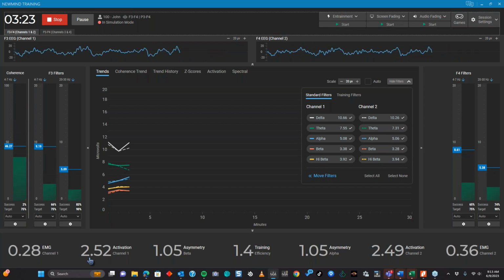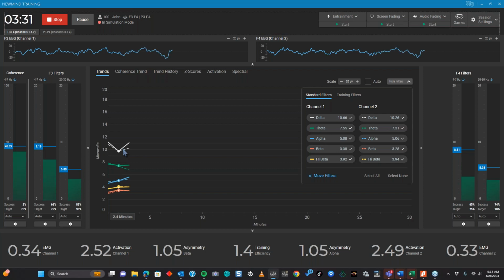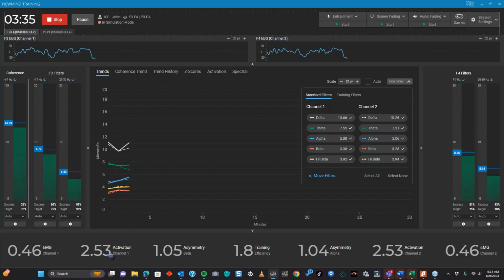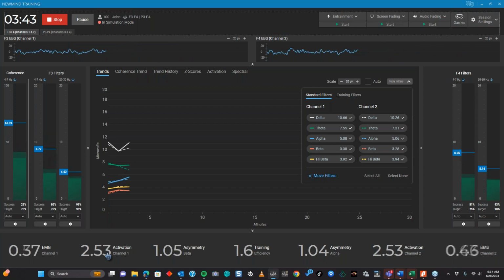Since Dr. Suter's been on vacation, in quite a few of these webinars we've been talking about artifact, because it plays a role in daily sessions. I see screenshots, or go into somebody's software and look, and I see it more than I would like to, where high betas are running upwards of 10 plus microvolts.